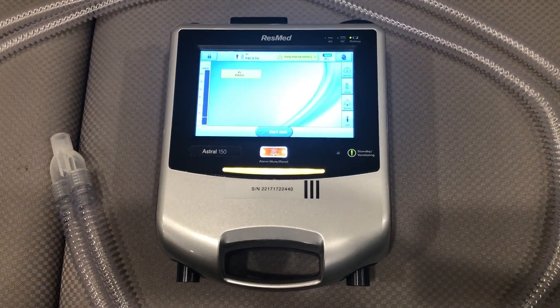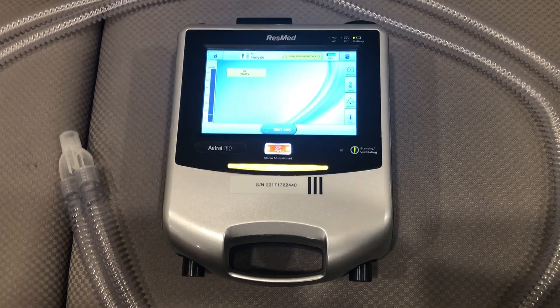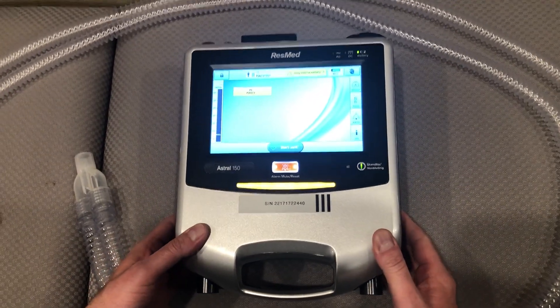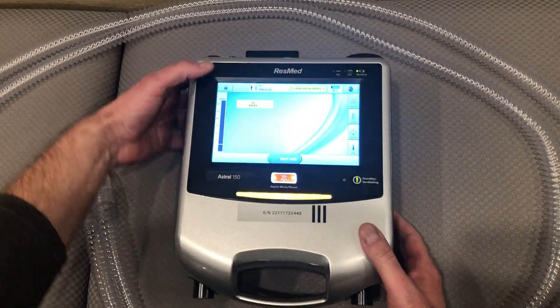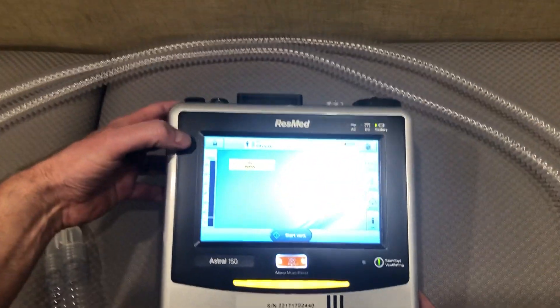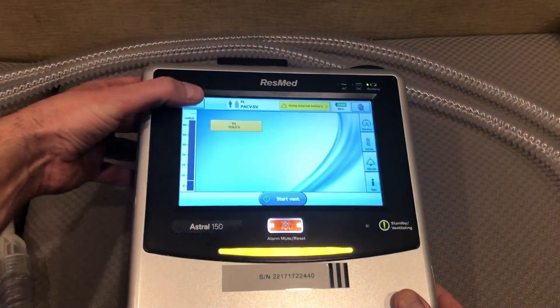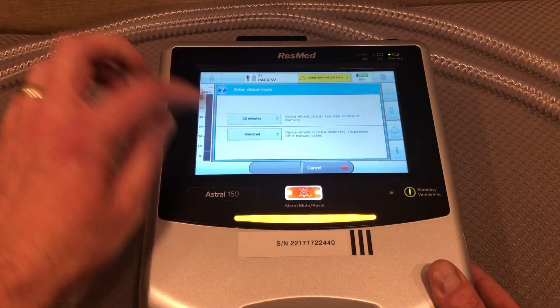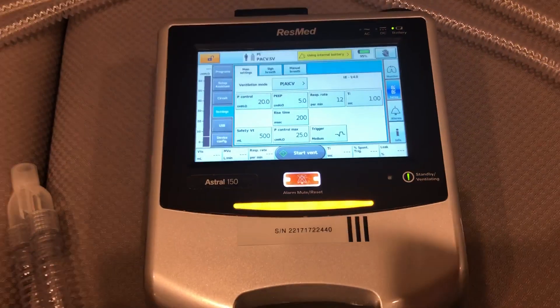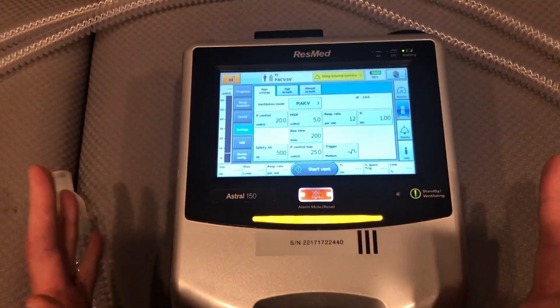The first thing I need to do is make sure that the unit recognizes that I'm going to be using a dual limb circuit. So I need to unlock it — you'll see there's a lock button here. I'm going to press and hold. I'm now going to hit 'unlimited' so that I can have as much time as I need to work on this unit.